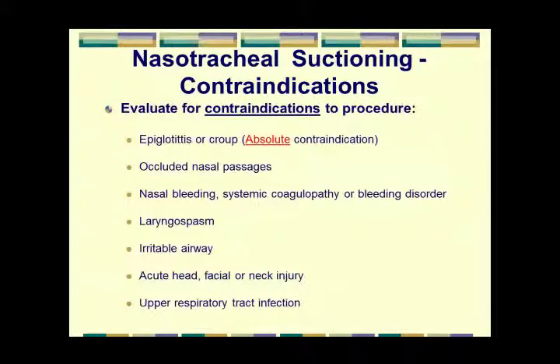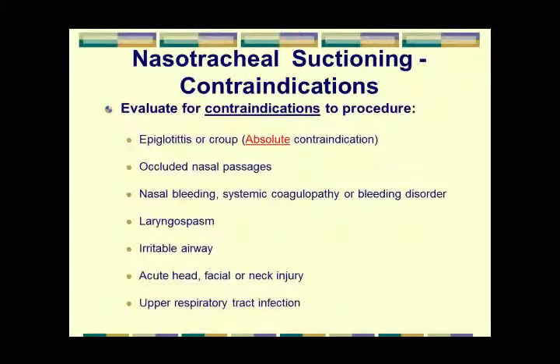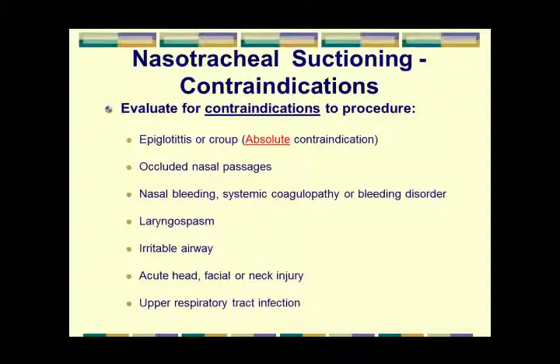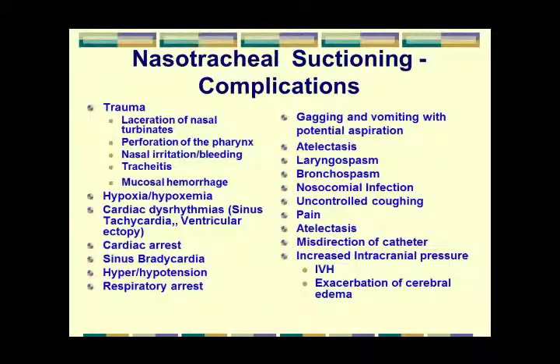Who don't we do nasotracheal suctioning on? Obviously, epiglottitis and croup are strict contraindications. Absolute contraindications, absolutely. Some of the other contraindications: occluded nasal passage, and bleeding disorders are a relative contraindication. Somebody who has hyperreactive airways, you need to assess the risk versus the reward of being able to do it. Same is true for the rest of them.